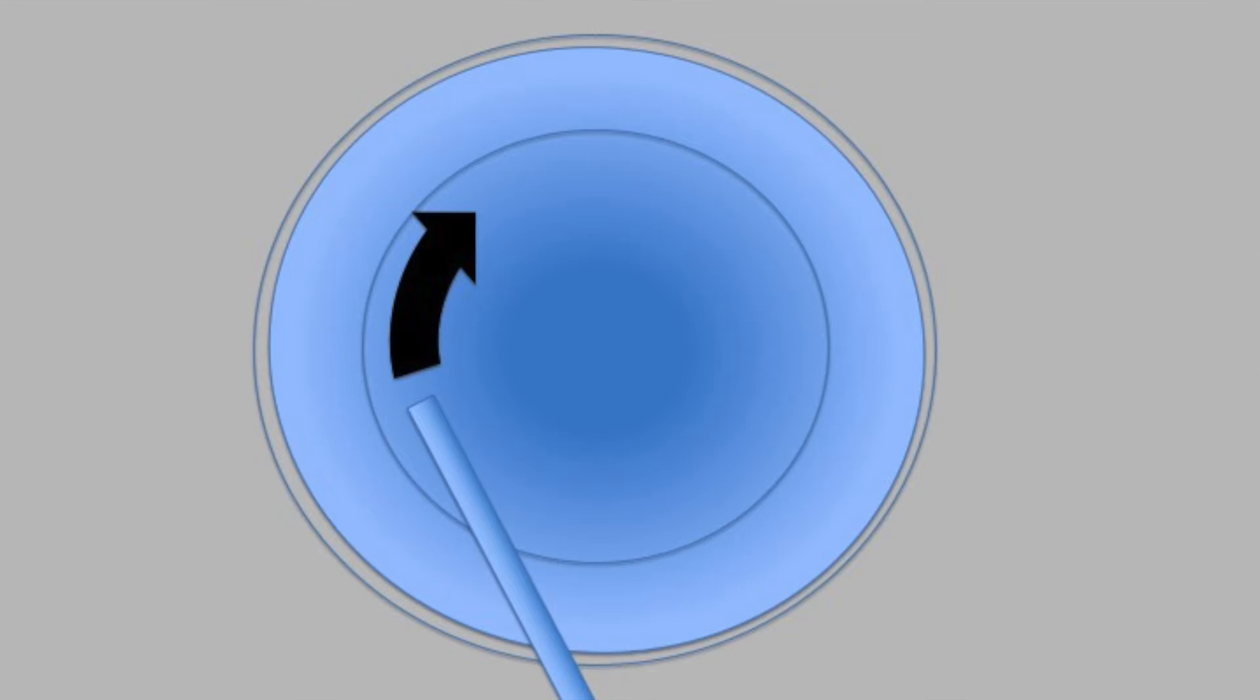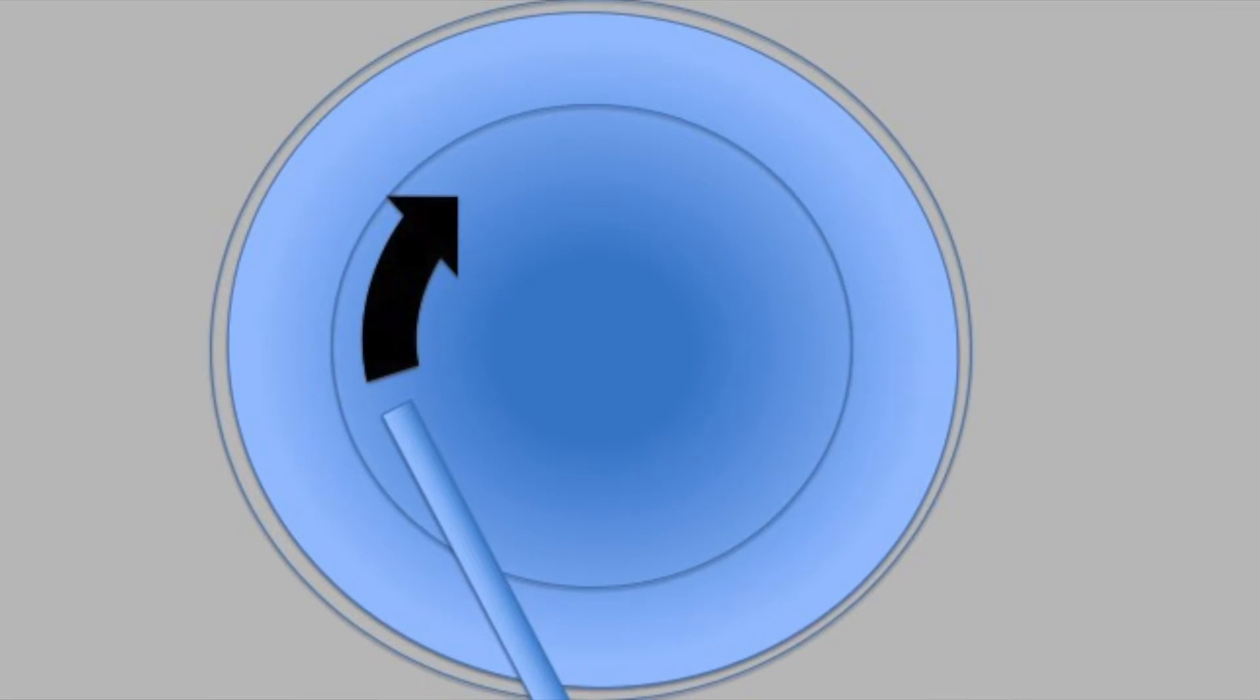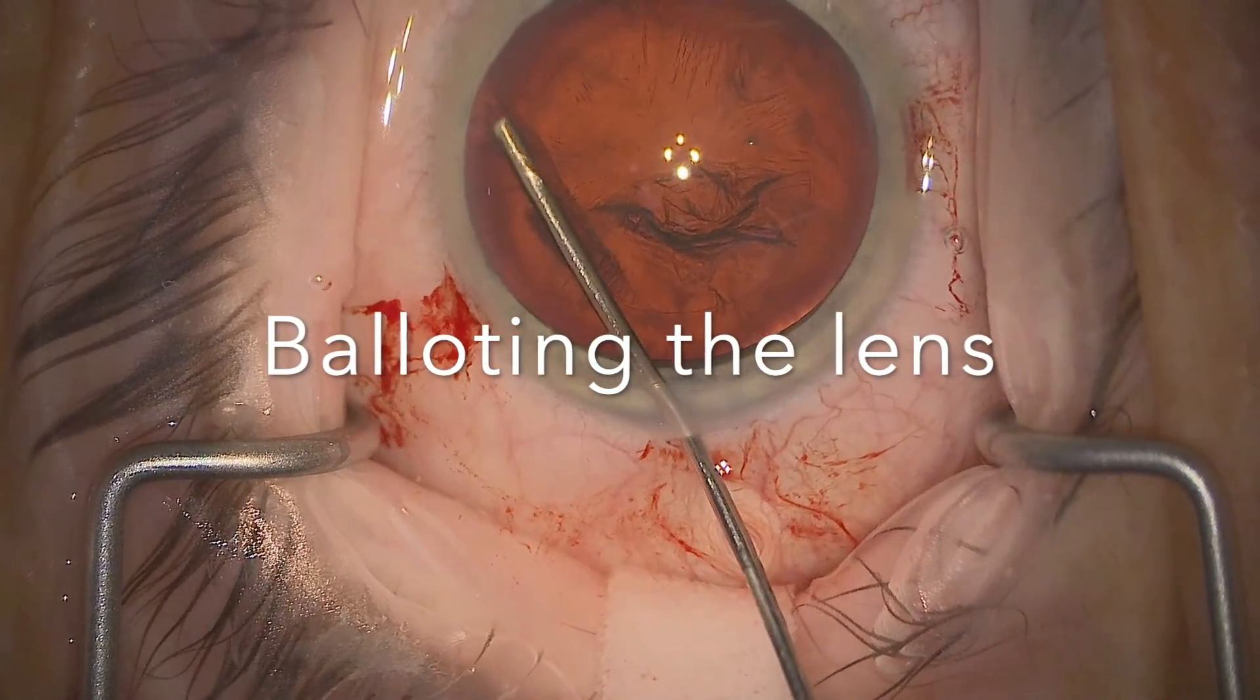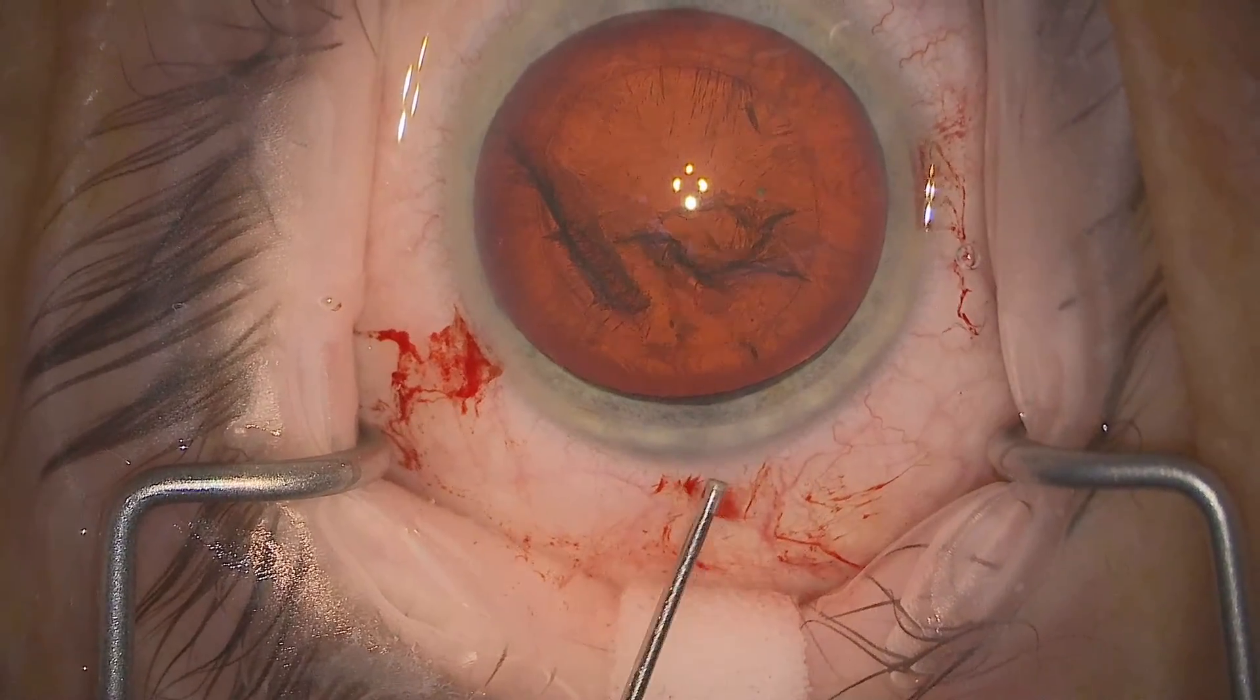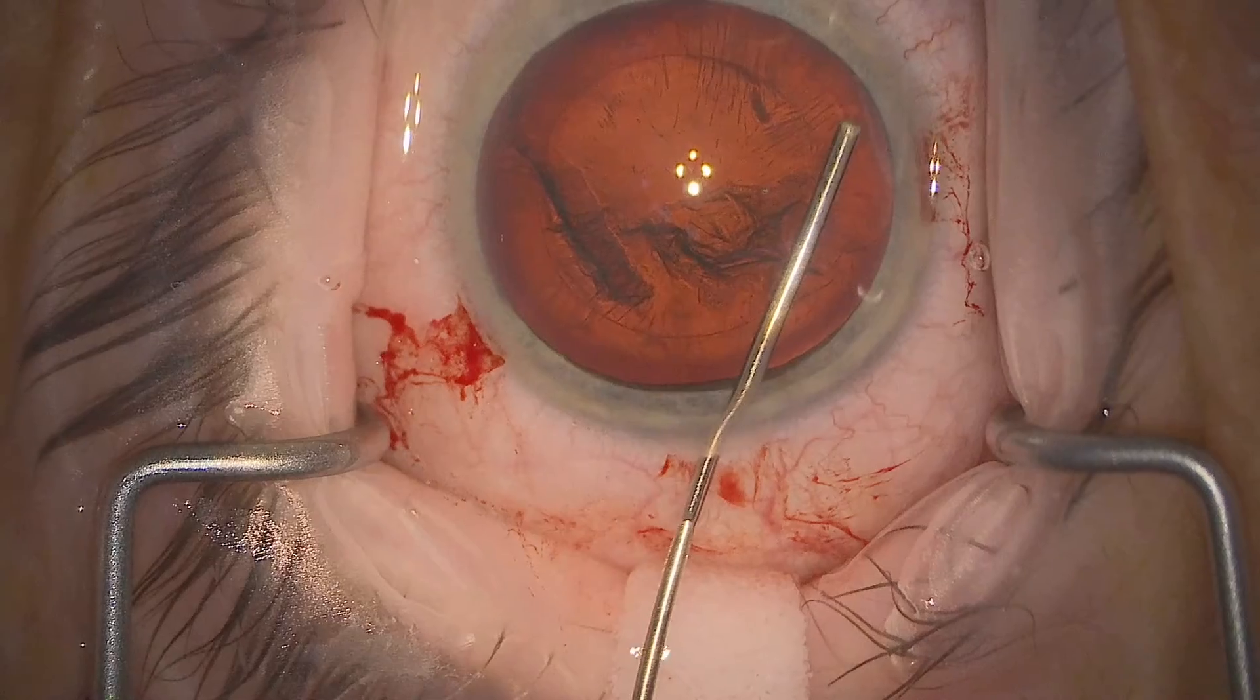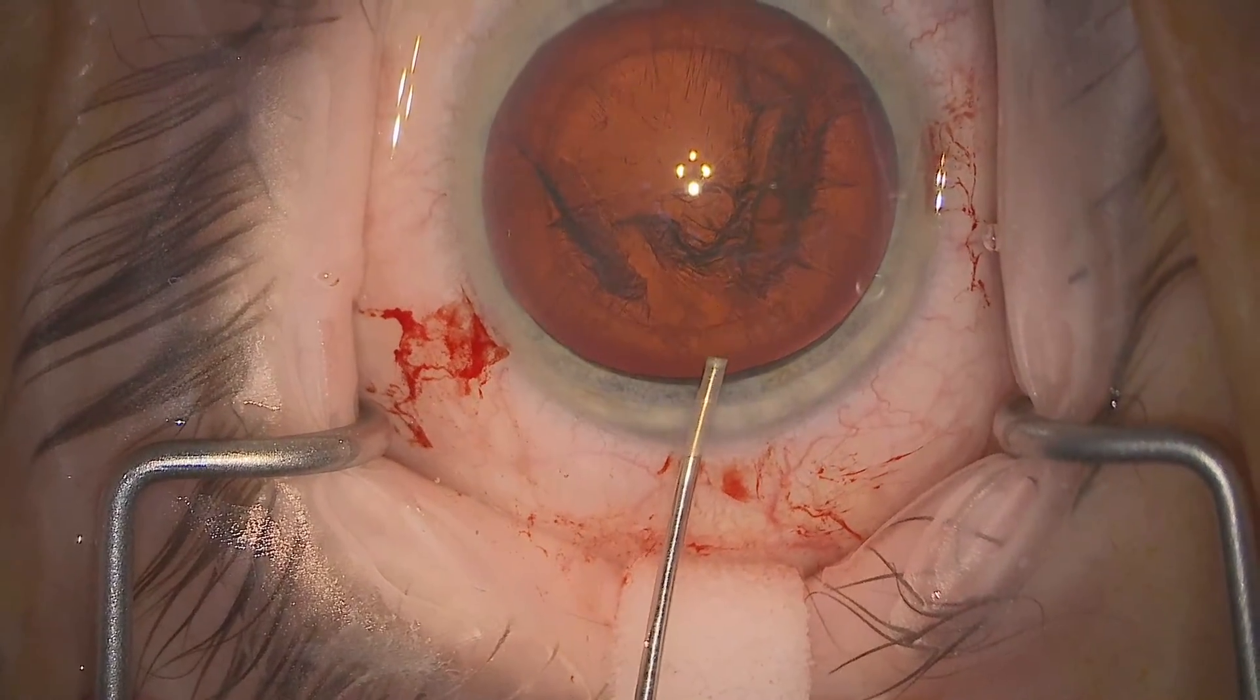Some surgeons teach rotating the lens with the hydrodissection cannula to confirm that it's free, but that's rather stressful for the zonules. I'm rather against rotating the lens in a soft eye whenever you can avoid it, and I think this blotting maneuver which we're showing you here is equally effective in demonstrating the lens is free and completely hydrodissected. As I said to you at the beginning, the more work you do with the hydrodissection, the less work you do rotating the lens subsequently, so it's nice to go to both sides and repeat this blotting maneuver to make sure that the lens is free.